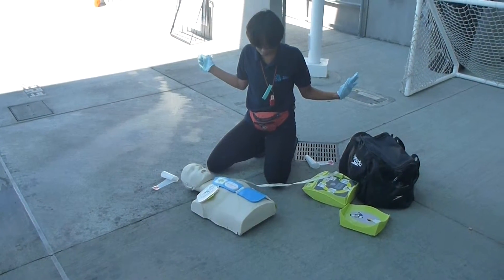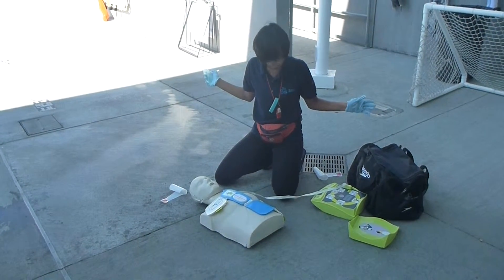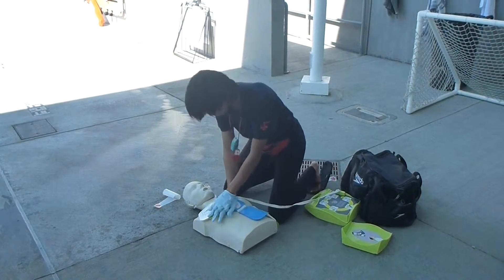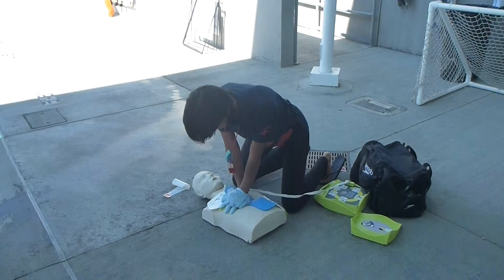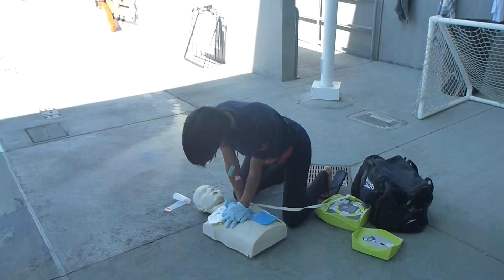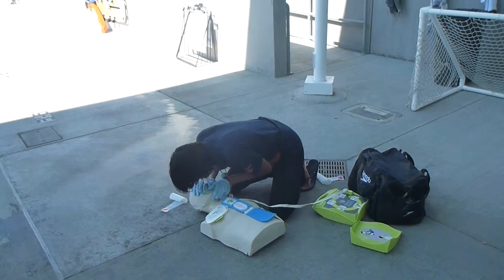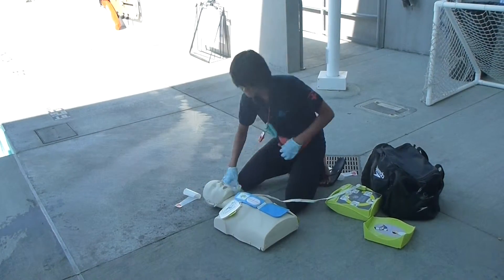35, 36, 37, 38, 39, 40, 41, 42, 43, 44 — 5, 6, 7, 8, 9, 10, 11, 12, 13, 14, 15, 16, 17, 18, 19, 20 — 1, 2, 3, 4 — 55, 56, 57, 58, 59, 60.